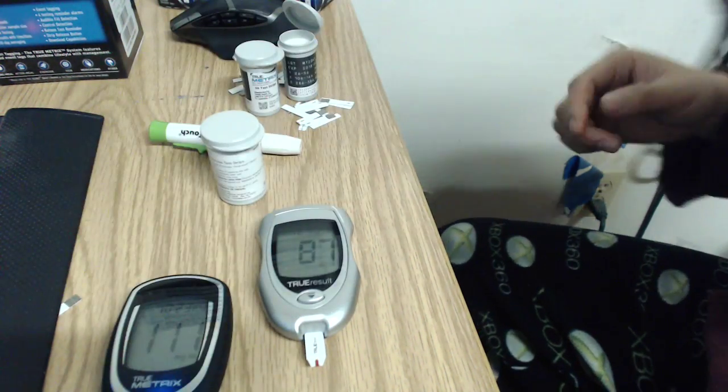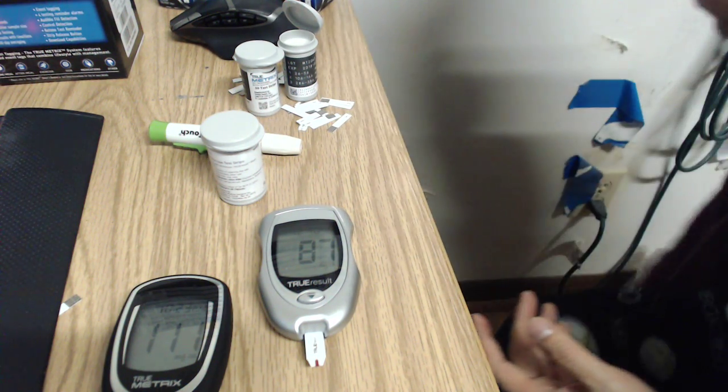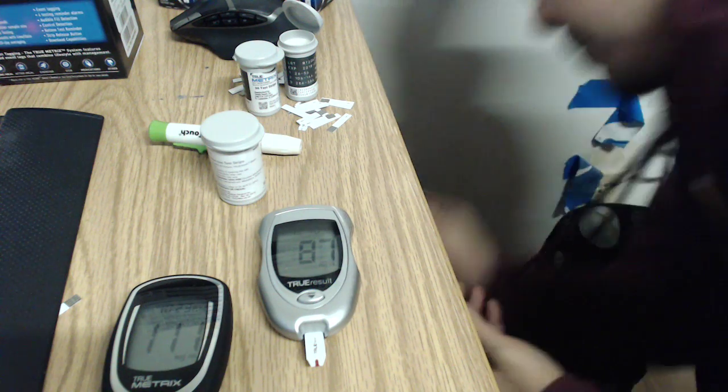111 — that's six points different right there for you guys to see. That's kind of a big difference. Let's do one more.